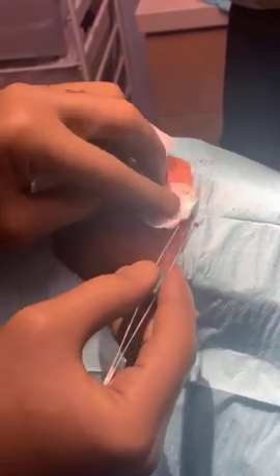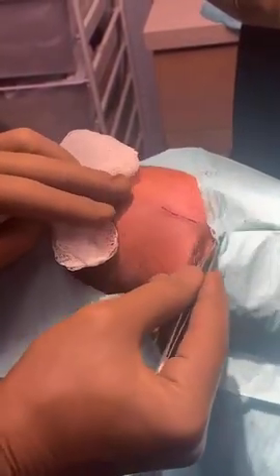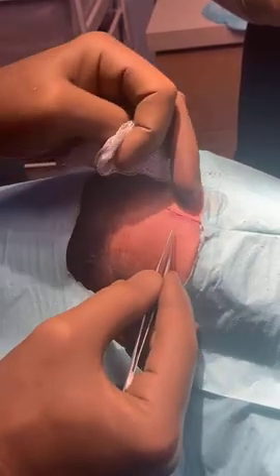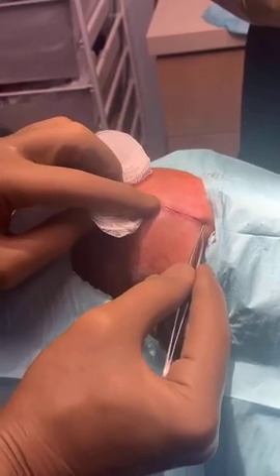I suspect when this heals, you're going to love this, and you're going to be like, Dr. Miller, I'm done, I love it, we can stop. And that way I was able to take out a scar that was 1 inch long and a half inch wide and maintain it within just a 1-inch vertical incision line. So there's your plastic surgery lesson for the day.